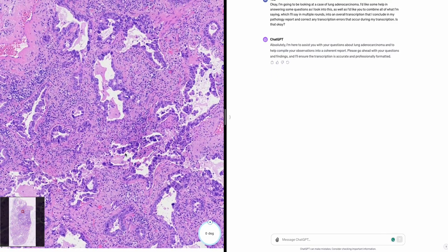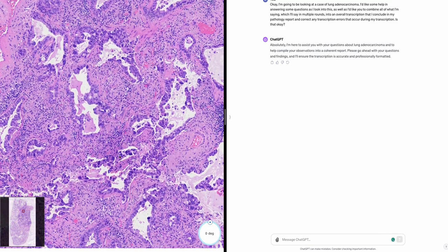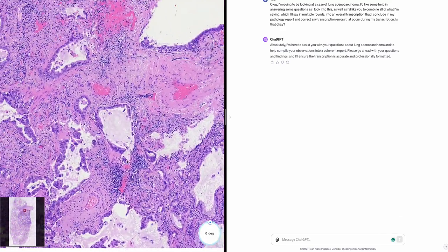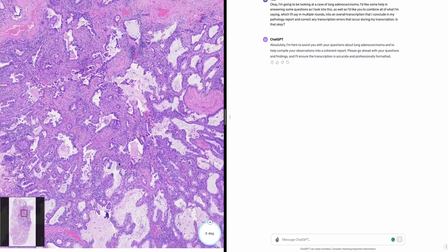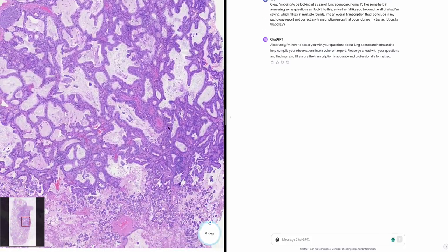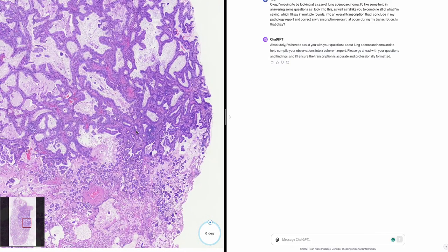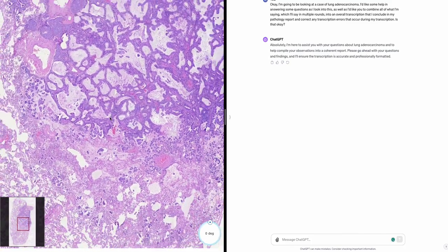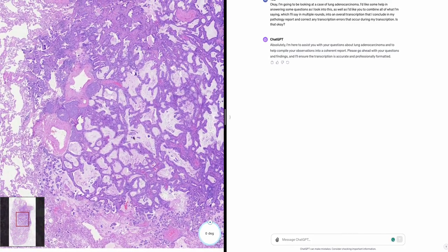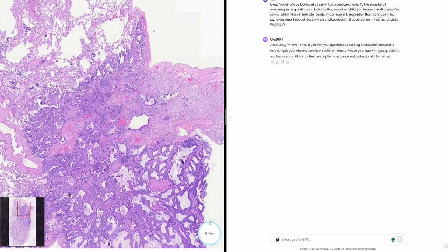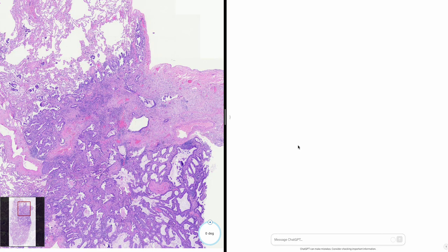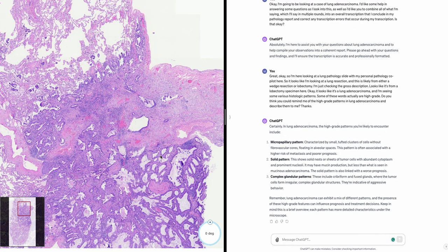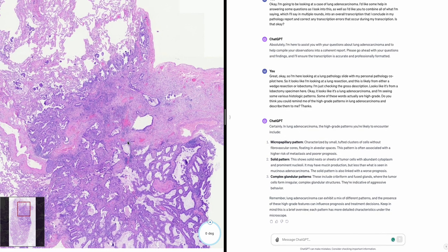Three, complex glandular patterns, including cribriform and fused glands, where tumor cells form irregular complex glandular structures. Lung adenocarcinoma can exhibit a mix of different patterns, and the presence of these high-grade features influences prognosis and treatment decisions. This is a brief overview — each pattern has more detailed characteristics under the microscope.